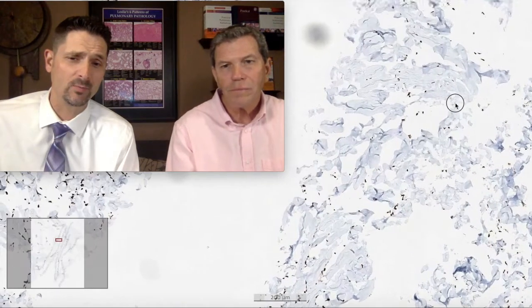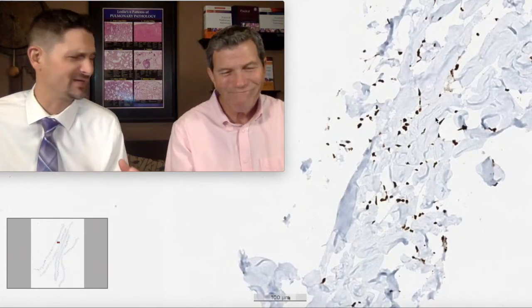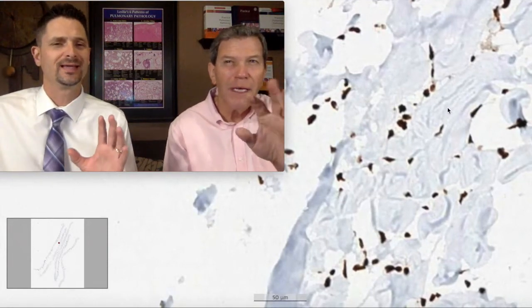Is that a nuclear stain? Should we be looking for a nuclear stain? That's the beauty of STAT6. Like you said one time in one of these videos, pathologists love nuclear stains because it gives you this sense of accomplishment, this nice, crisp nuclear stain. You're not sitting there wondering, is there a little bit of cytoplasmic blush or not? Is that little napsin around the edge? Yeah, this is a nice nuclear stain, and you can see every single cell. And actually, I would say there's far more cellularity here than we recognized on the H&E. Wow. Every cell strongly positive.